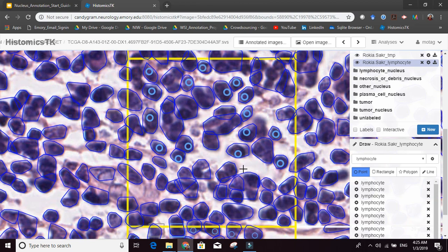So what I'm doing now is finding nuclei where the algorithm was correct, both in terms of the label and in terms of the boundary. So all of these are correct. These are all lymphocytes. This one, you can see the algorithm kind of clumped them together. They're actually 2 lymphocytes. So in this case, I can't place a dot. What I do is I place a rectangle around each nucleus. So this is one lymphocyte, and this is another lymphocyte right here. Okay? Now let's go back to the dot and find any other.